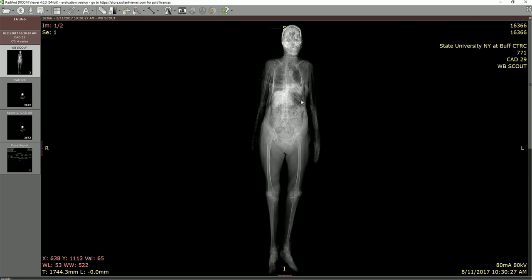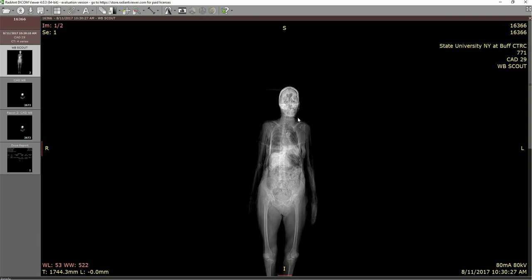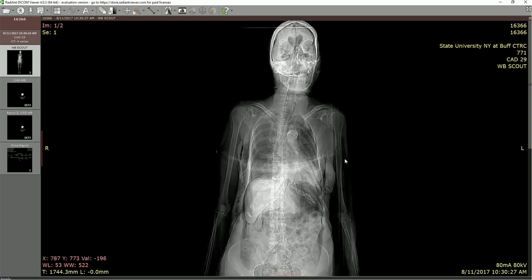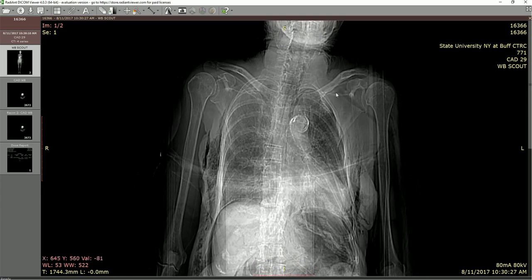Here we're seeing the general overall radiographic view, which gives us a chance to see if there's anything of significance with this individual. Pressing the M button and clicking and pulling down allows me to move into a certain plane. Pressing Z and holding down the left mouse button allows me to zoom in and out. Something to notice as we go through the axial CT images: with a lot of these cadavers, the arm gets pushed up a little, so you can see a bit of elevation to the clavicle.